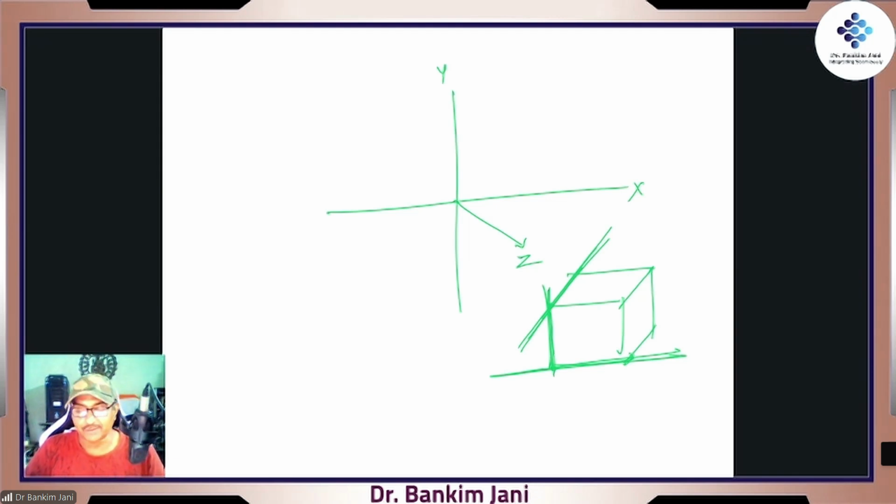The heart is a 3D structure, so we have to watch the heart from every angle. That's why there are various angles. When we talk about the right arm and the left arm, this is one plane. Right arm and left foot is again one plane. But it does not tell the posterior or the anterior part. That's why the chest leads come, where we are watching the heart from the front.